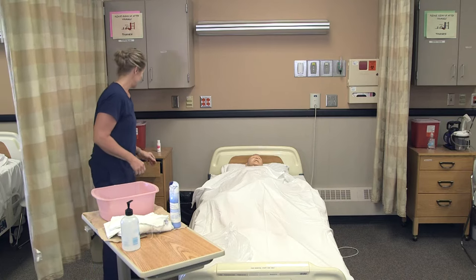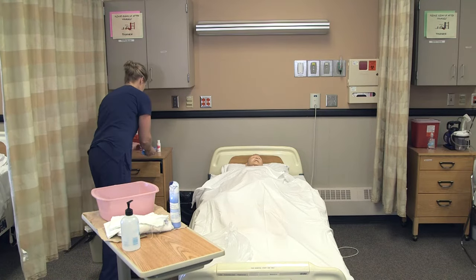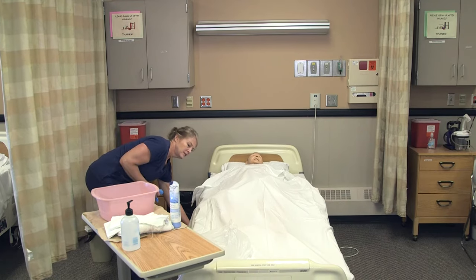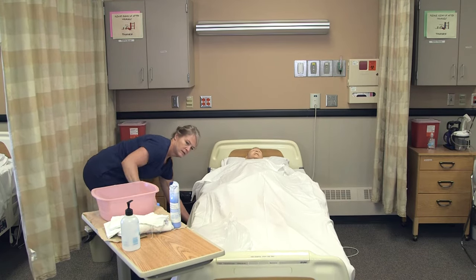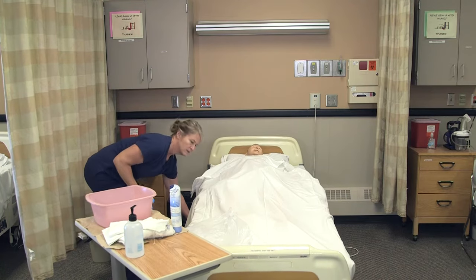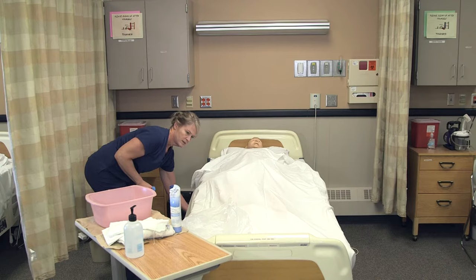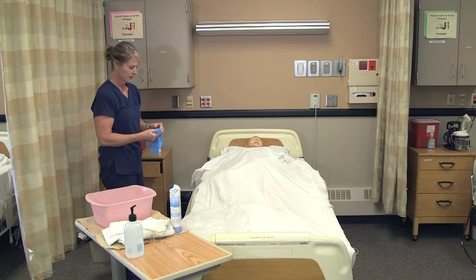I would take the resident's basin and get some warm water. I'm going to raise the bed up to my working height and get my gloves on.